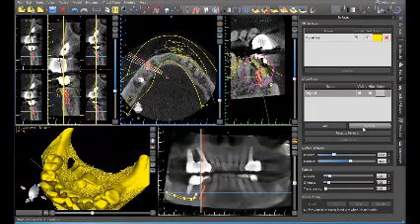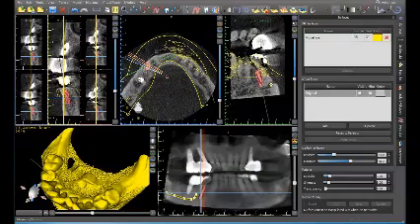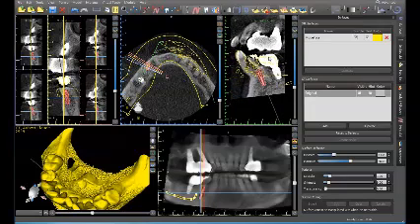Let's do that. Let's see. Because I want to be 5 millimeters away from that canal, but I don't want to slip in that root. So what I'll do is extract the tooth, form this osteotomy, graft this distal portion, and place my implant in the ideal position.